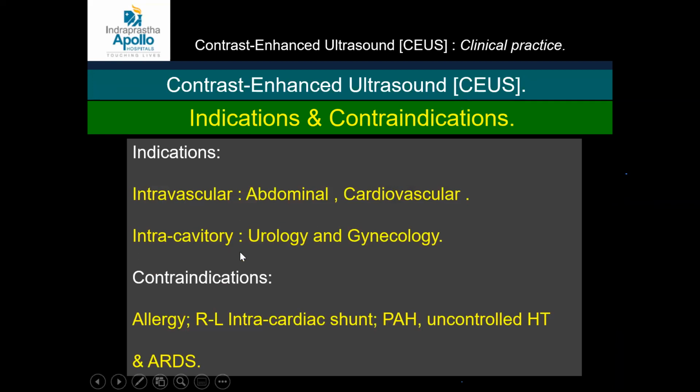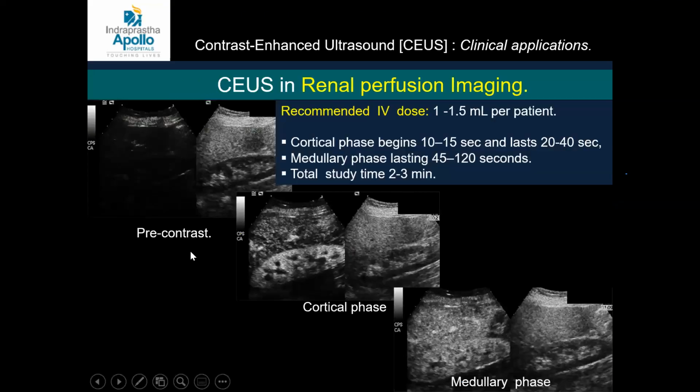Even a lesion in the spleen can be evaluated. Intracavitary use in urology and gynecology is also known. And there are very few contraindications. Echocardiography also uses this contrast in patients where IV contrast cannot be given. So these are the examples.